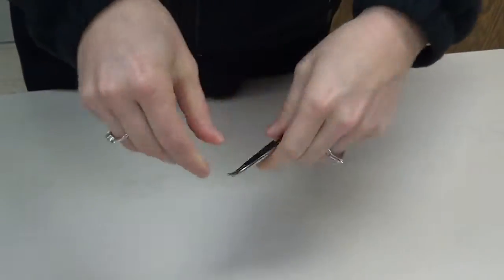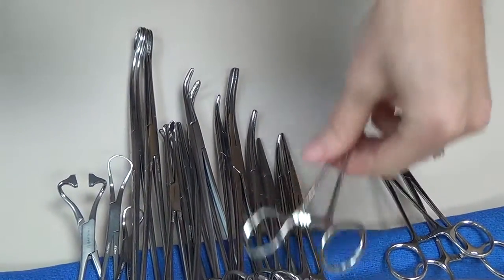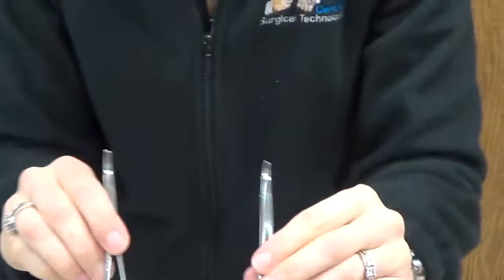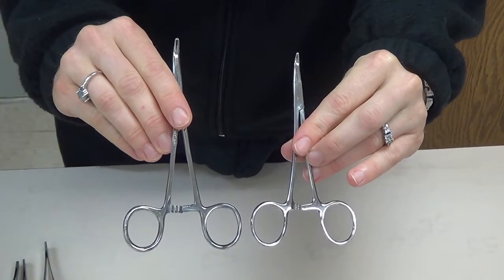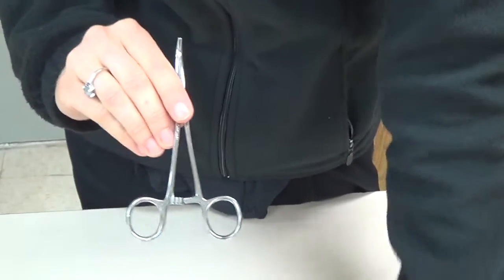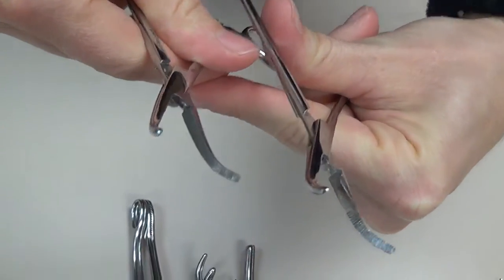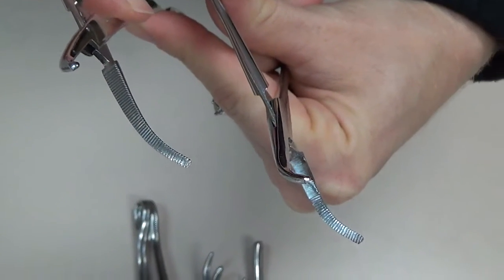The next size up in our hemostats is what we refer to as Kelly's or Crile's. The difference between them is the serrations on the inside. Compared to a mosquito, it's still pretty fine and utilized with smaller anatomy, but a bit bigger. On the Kelly, serrations only go partway down, whereas on the Crile, the serrations go all the way down to the box lock.